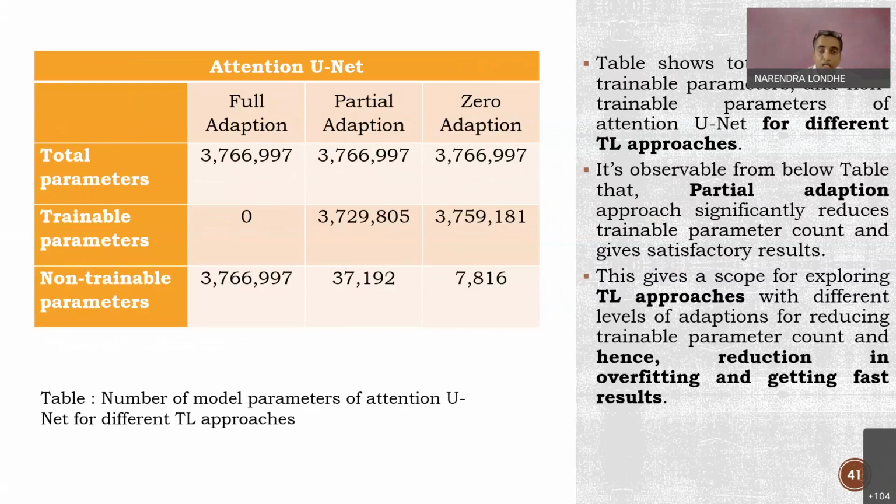Yes, in the transfer learning also we have checked the computational complexity. See, every time you come out with one method having better performance, you should not declare it as the best thing. If it is taking a lot of time and a lot of computational power, then those methods are not able to adapt for real-time applications. Their computational complexity should also be low.